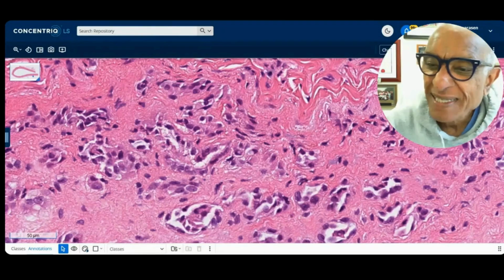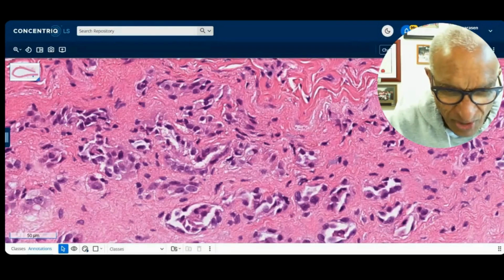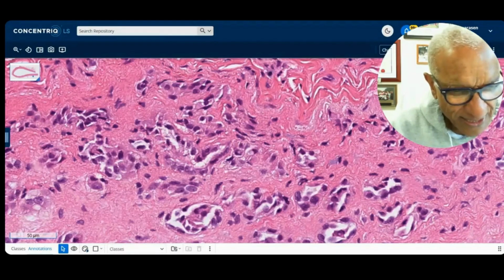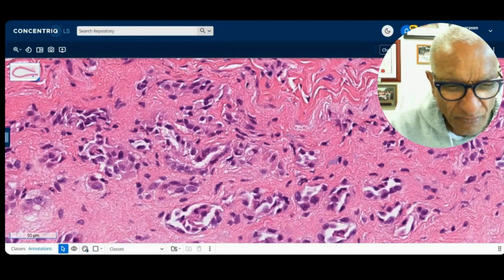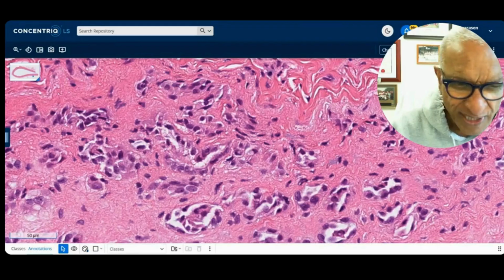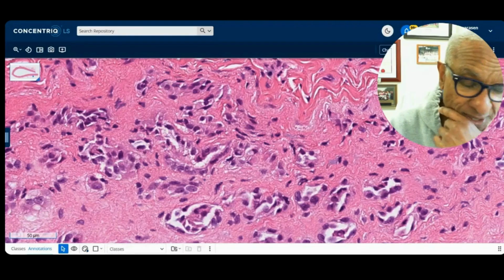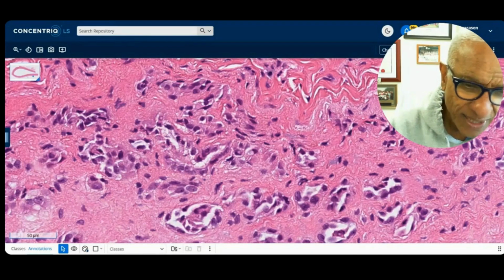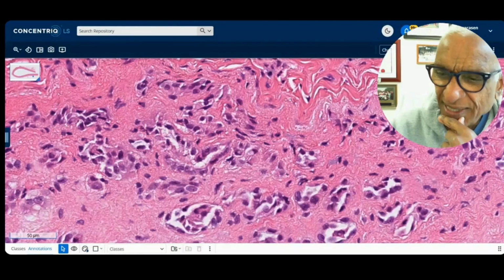And that, Tiba, is the real reason why I'm showing you this case, because that's always a suspicion for whether these are carcinoma. In fact, as a sidebar, let's look at the adenomatoid tumor that you see in the uterus or paratesticular distribution. Those form little glands, and those can be misdiagnosed as metastatic adenocarcinoma. So I suppose you could do the same thing here. And understanding and knowing this lesion as well as those adenomatoid tumors that we see in the lower pelvis is also useful, because once you recognize one and you do the stains, you would recognize that all the time.